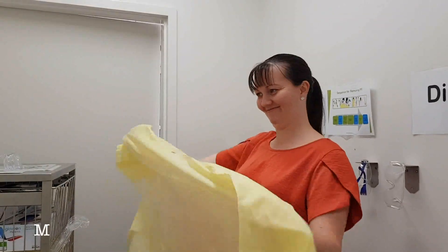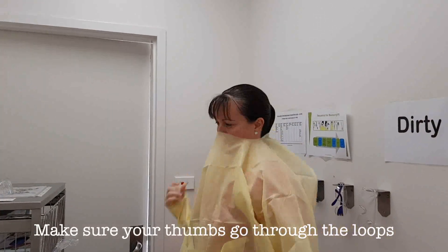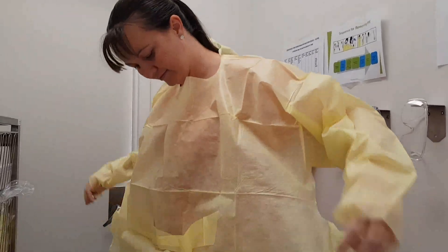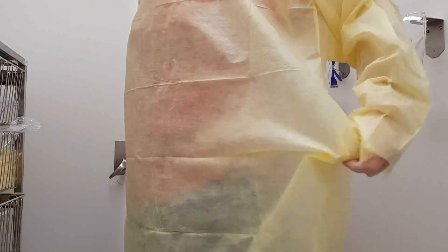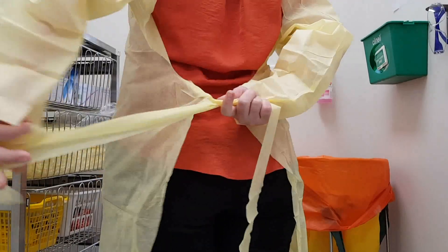Apply your gown first, making sure that it's well fitted and tied at the back. You can make sure that you've hooked your thumb loops over your thumbs to stop the sleeves from riding up.